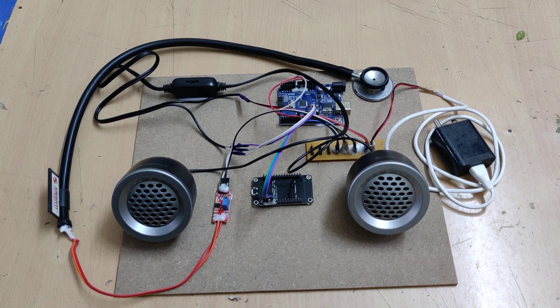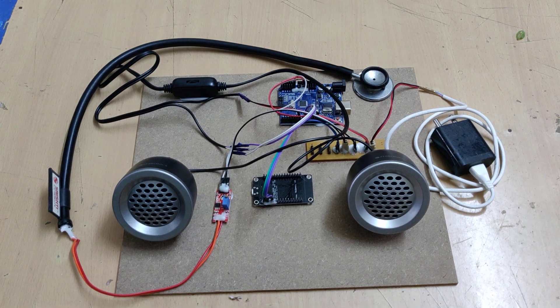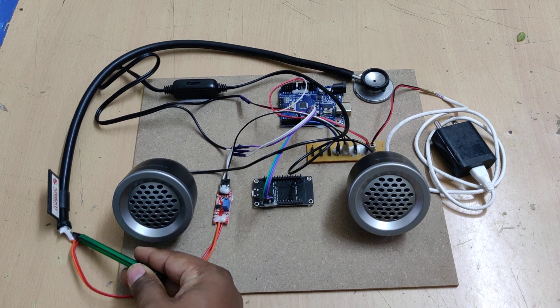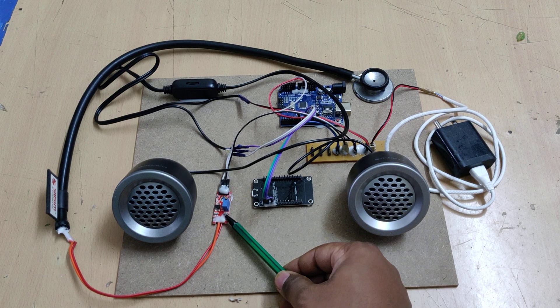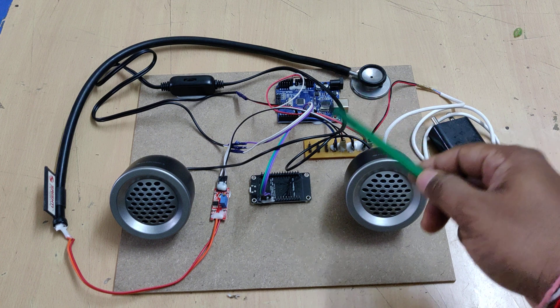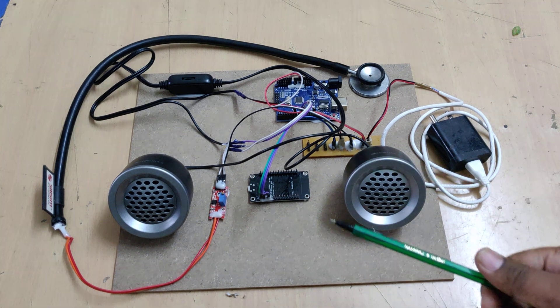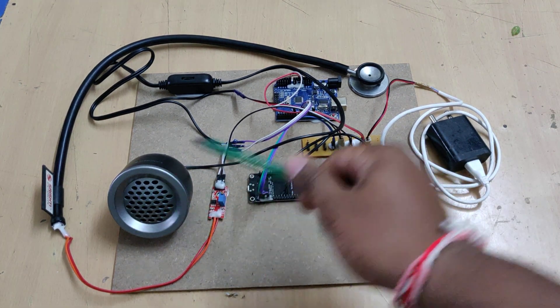Welcome to the project demonstration of Digital Stethoscope, which takes sound from a stethoscope as input to the microphone. The microphone is attached to the stethoscope and the signal is amplified through an amplifier circuit. From there, the signal is given as input to the UNO board, transmitted to the Node MCU, and then converted from an analog signal to a tone signal, which is output directly to the speakers through connectors.